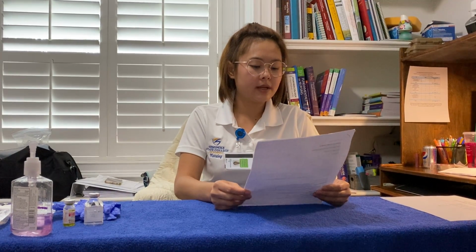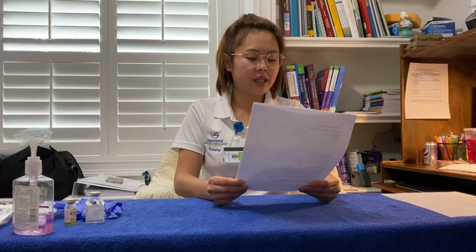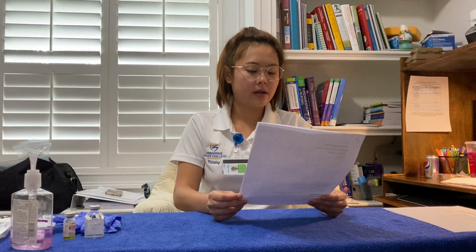So I have influenza vaccine 0.5 ml, give it IM, once, to prevent the flu, and the time is now. Documentation needs to be done. And then B12 500 micrograms sub-Q, give it once a month, and the time is now. Also documentation needs to be done, so I'm going to compare with my MAR. Okay, Anna Pawlowski. Alright, influenza 0.5 ml IM, give once to prevent flu. The time is now, everything matches.